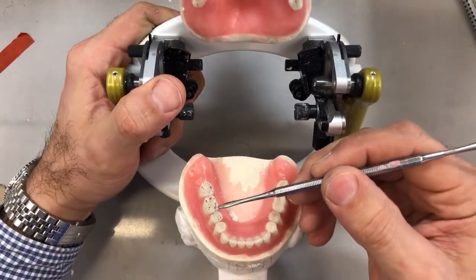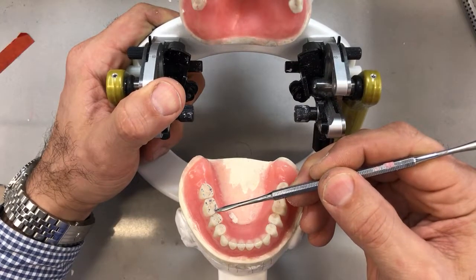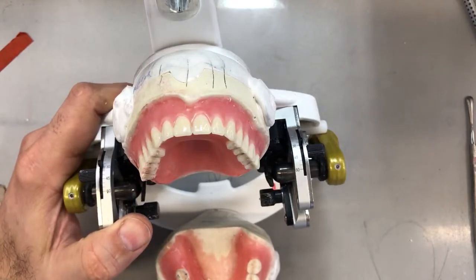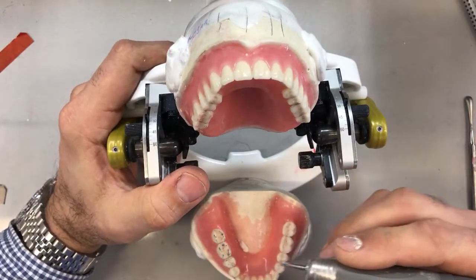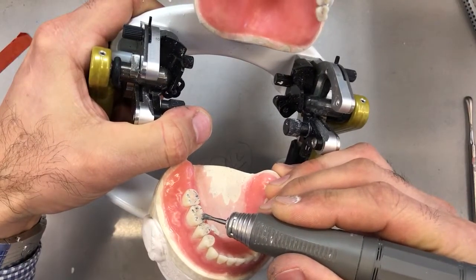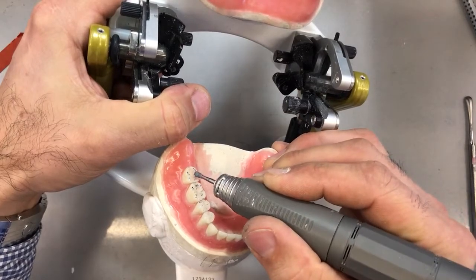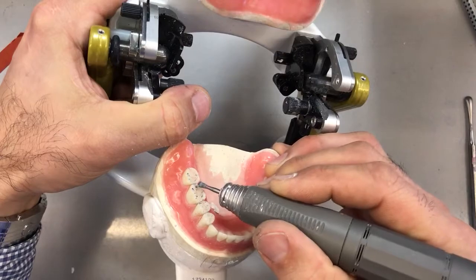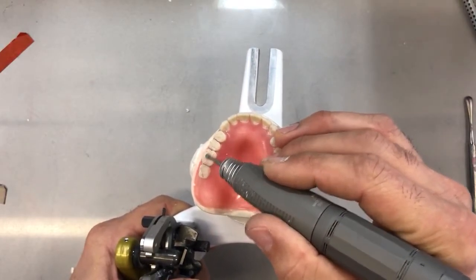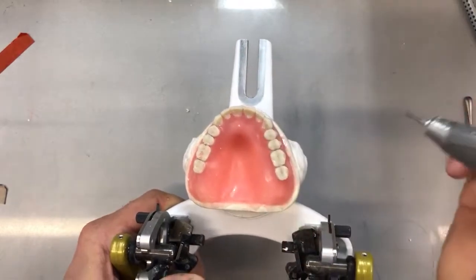Opening up to see what we have: there is lingual interference of the lower lingual cusps right here — pretty much in line with our BULL rule. So we're targeting the lingual lower inclines and the buccal upper inclines. We're going to do this in small increments. When using your burr, try to hold it at an angle so it follows the angle of the incline you're trying to reduce. I'll work a little bit here and mostly back here on the buccal inclines of the upper, working around the cusp tip as much as possible.